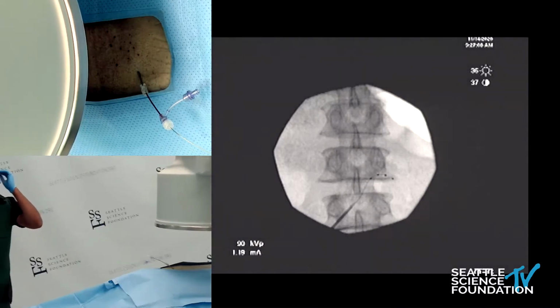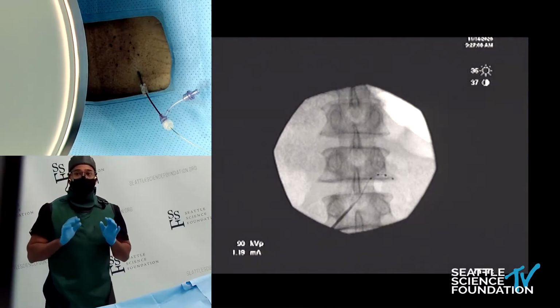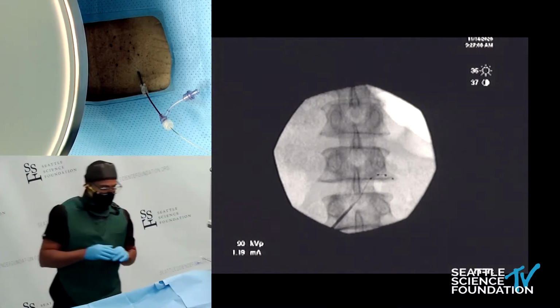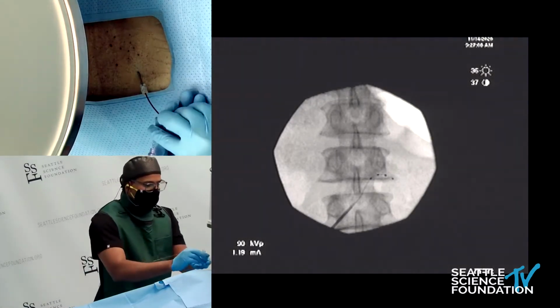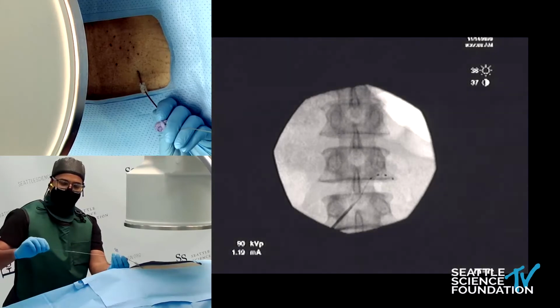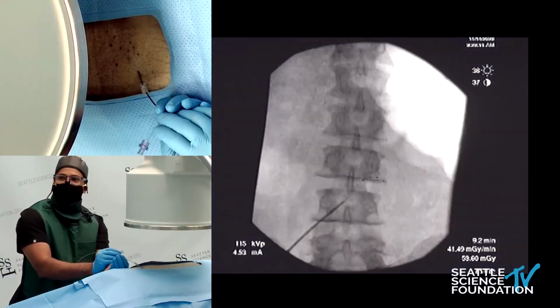But actually, in my opinion, this is where it begins, because now the most important point is ensuring you have good tension relief loops. This is what's going to be your anchoring system with DRG. So first thing I do is I take out the stylet. I'm going to create that lead to cooked pasta. Now it's just going to sit in that space, okay?